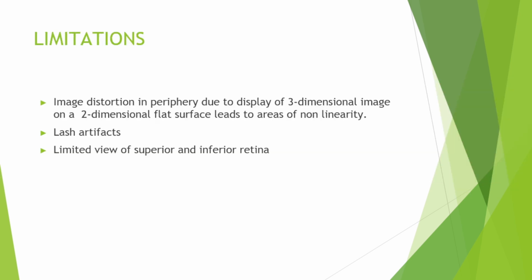As I already told, the limitation is that the resolution is slightly lesser, and there is image distortion in the periphery as the 3D image is converted to a 2D image. Lash artifacts can be there, and there is limited view of the superior and inferior retina.